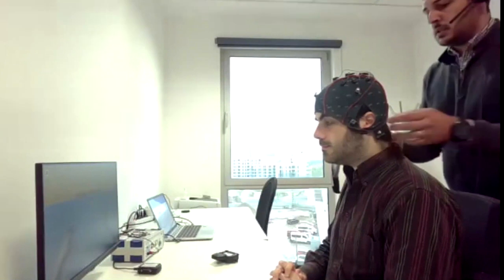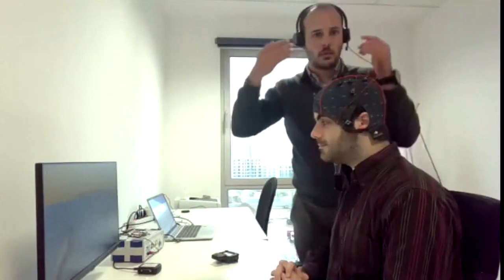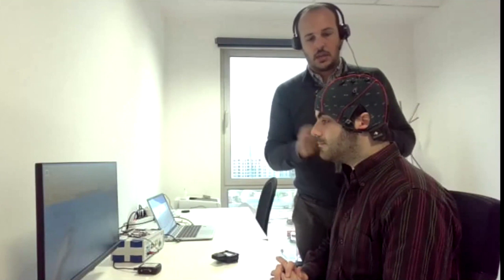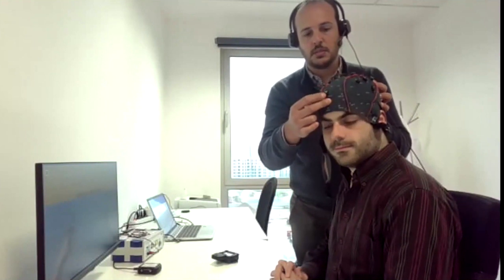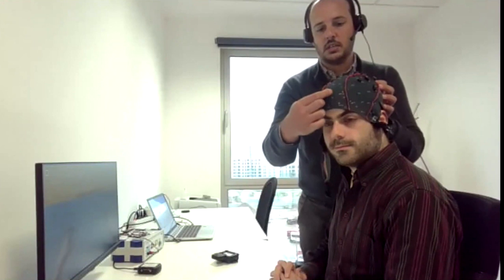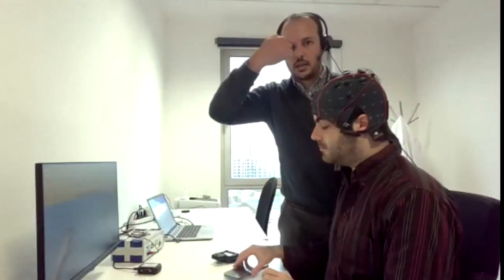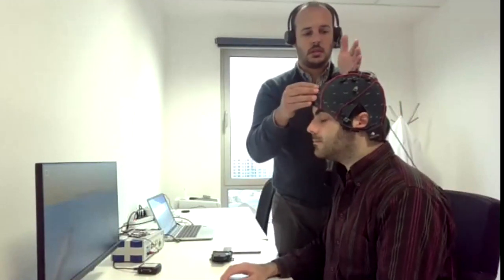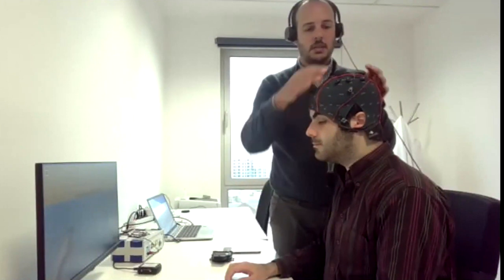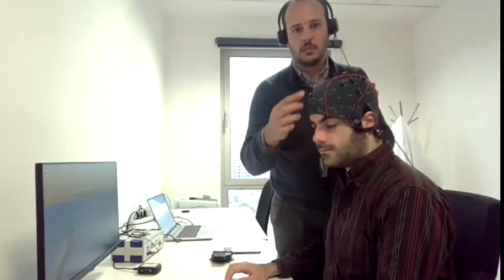Okay. So it's important that the central line of electrodes is more or less over the ear. And also we have this special electrode in the front, which is in yellow color. I think that you cannot see it from the distance, but the electrode that we have in the front has a label in yellow. So this electrode should more or less be arranged in the line of the nose, okay? If you consider these 2 things, then the cap will be correctly placed. The central line of electrodes over the ear, so over here, and the yellow electrode over the nose, okay?